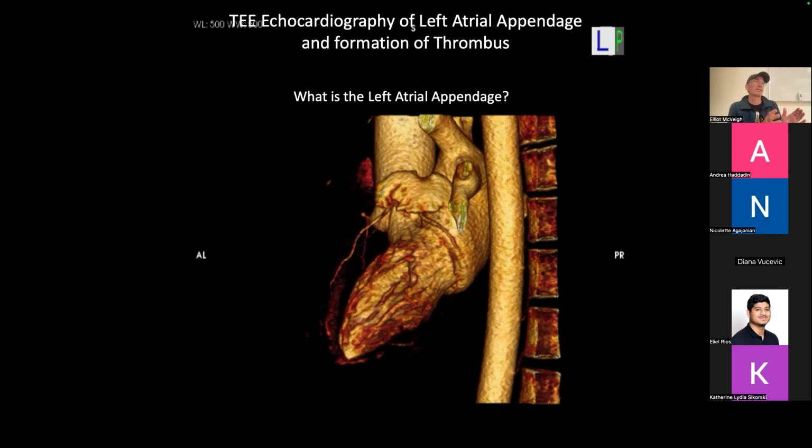fluid mechanics problem, in that there's a little spot, and this can happen at the tip of your left ventricle, right? You can look at the flow map in the left ventricle, and for whatever reason, maybe it's kind of prolate because there's damage to the wall. There'll be a spot where the blood comes down and just kind of misses it, right? And it's very idle in that spot. And so that's the problem.